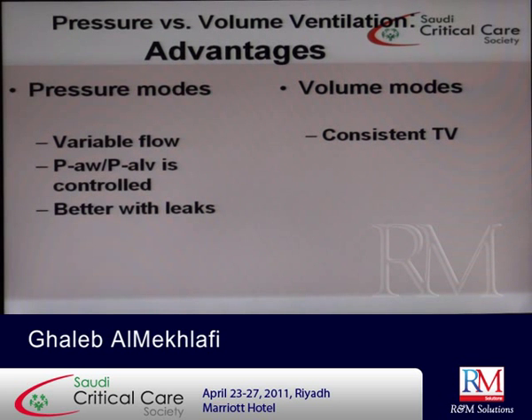Now, in volume modes, there is a consistent tidal volume. This is an advantage. Okay. So that volume or minute ventilation that you preset for the patient will be delivered to the patient. So you are happy that all the volume that the patient needs will be delivered to him, and you can make sure that the minimum minute ventilation will be delivered. So I set for the patient 10 breaths per minute of 500 ml, so 5 liters per minute will be delivered to the patient. And I'm sure about that.